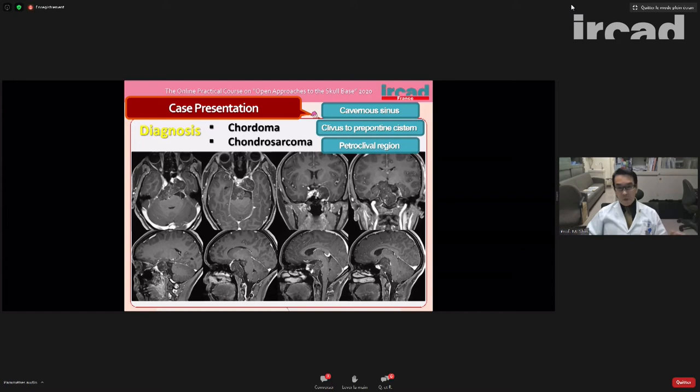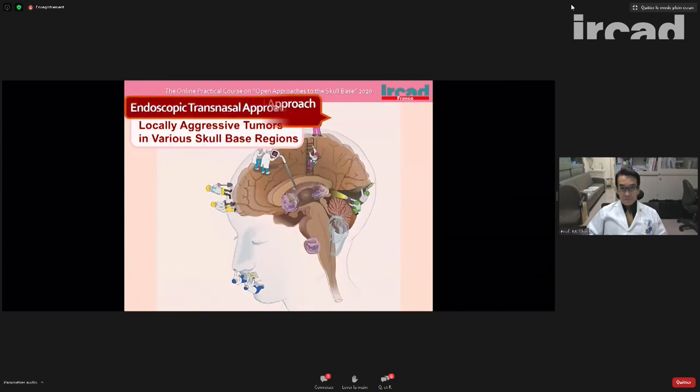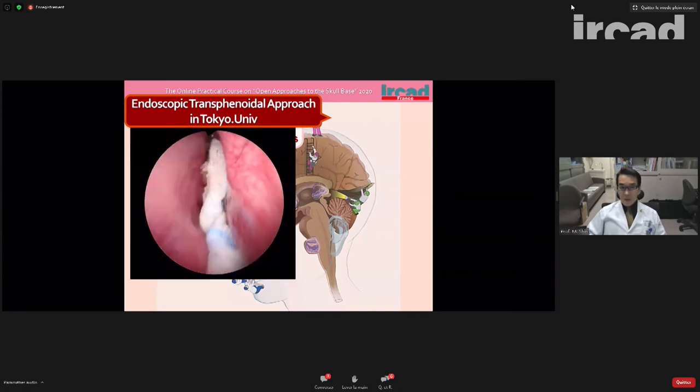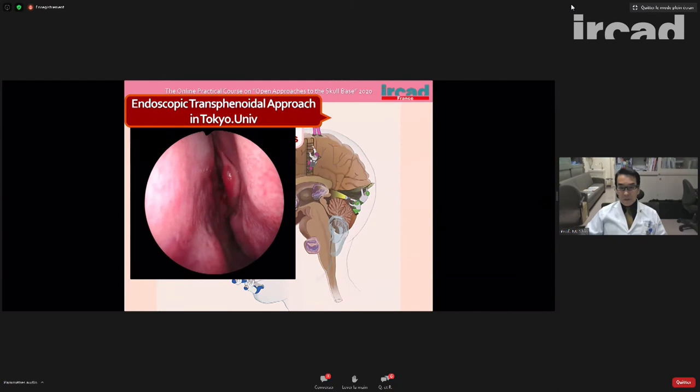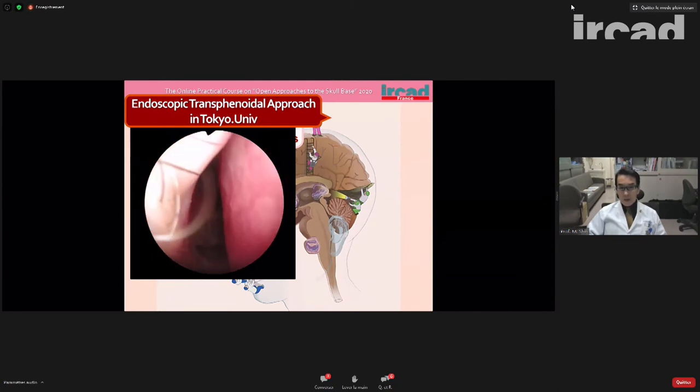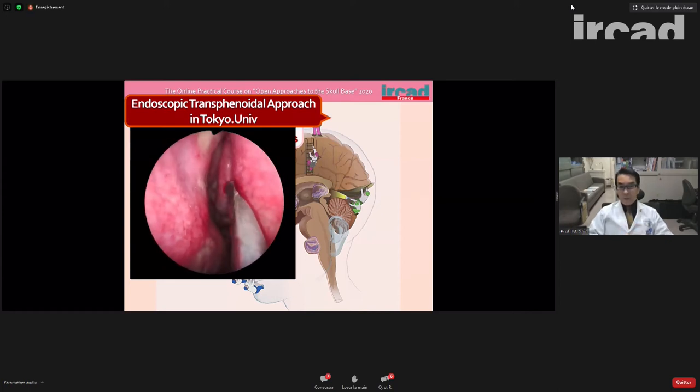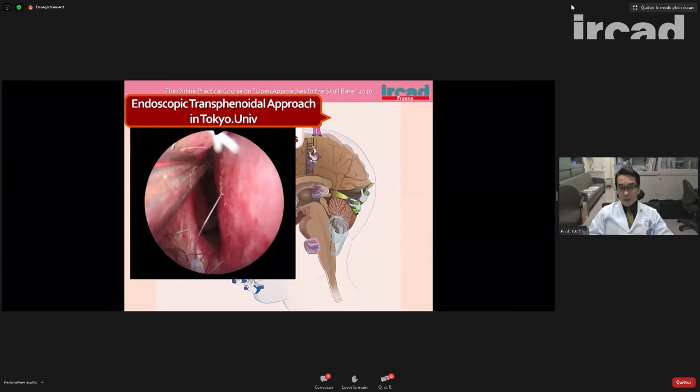But in which way? Is the endoscopic transnasal approach feasible or not? So first of all, I will introduce our approach method. This is our endoscopic transnasal approach. We usually use the nasal speculum, and we put the nasal speculum in each nostril.